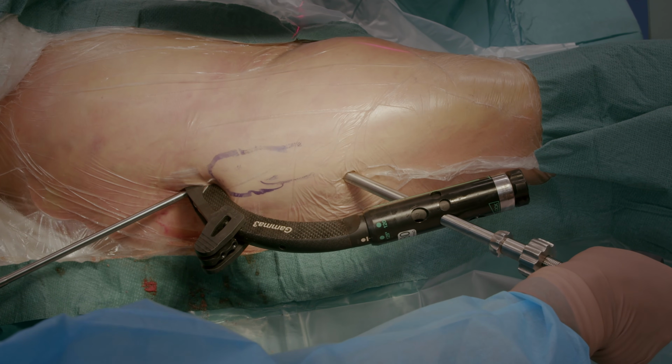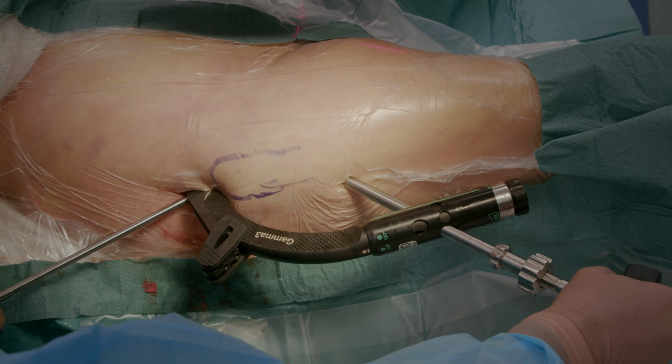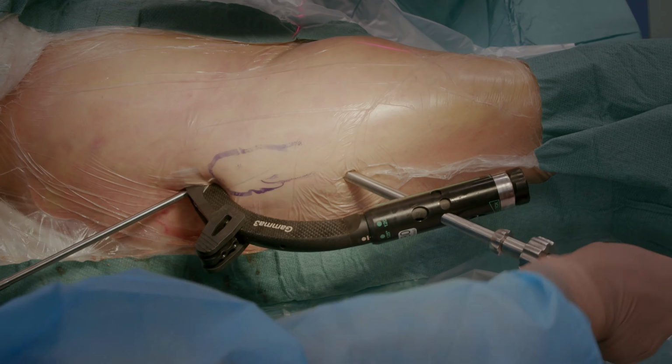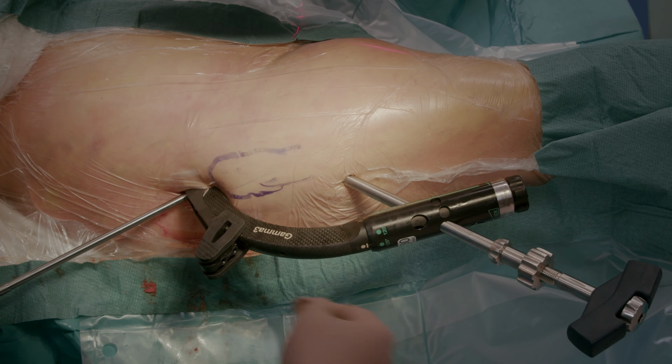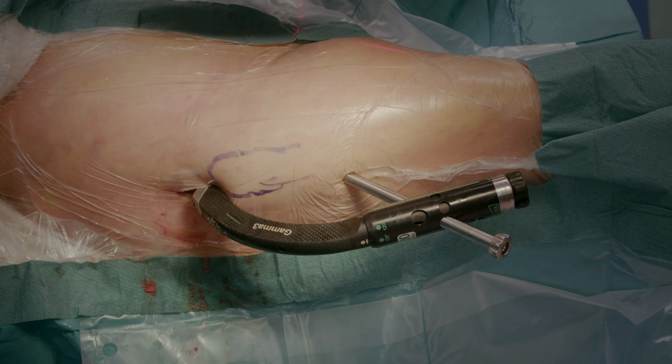Then we unscrew the set screw a little, about 1/4 of a turn, so that there is slight movement here, allowing the femoral neck screw to slide, but preventing it from unscrewing. To prevent implant failure, do not unscrew the set screw more than the earlier mentioned 1/4 of a turn.